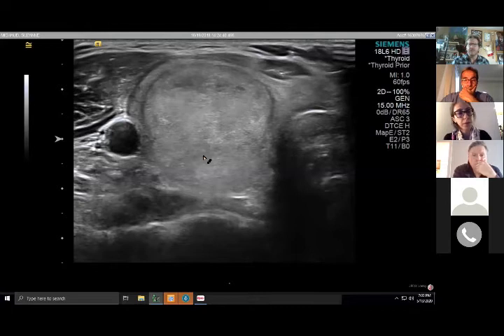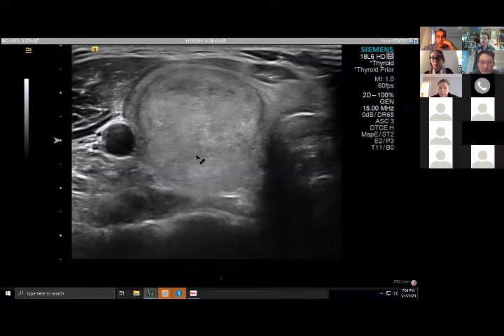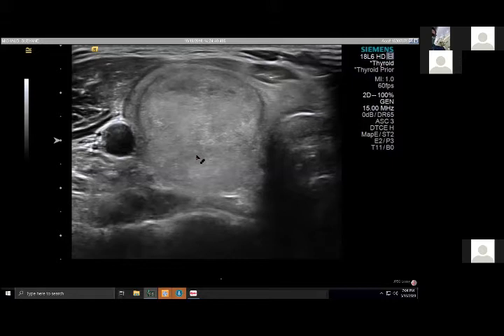So I will be showing the nodule itself. We won't be going through the entire thyroid ultrasound. But the reason we are doing the thyroid ultrasound, at least from a radiology perspective, is to provide you an action stratification. Beyond describing the features, we used a standardized protocol approved by the American College of Radiology called TI-RADS. TI-RADS comes up with a score at the end, which Dr. Gibby will show soon after me. And per this score, we are providing you action stratification about what to tell the patient.